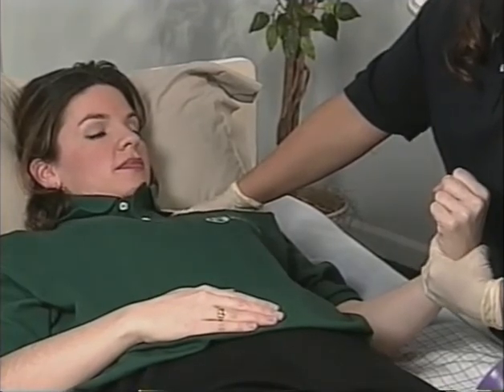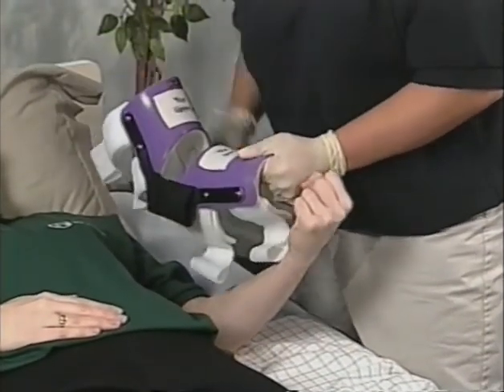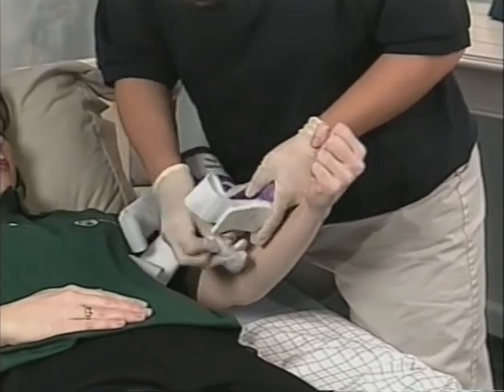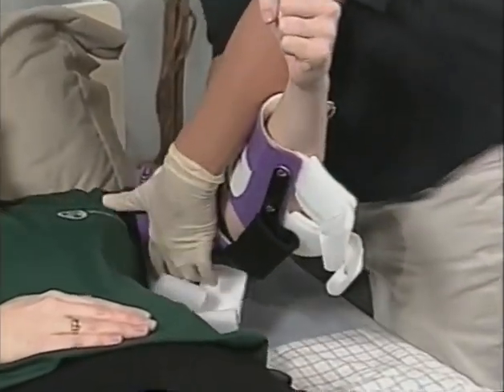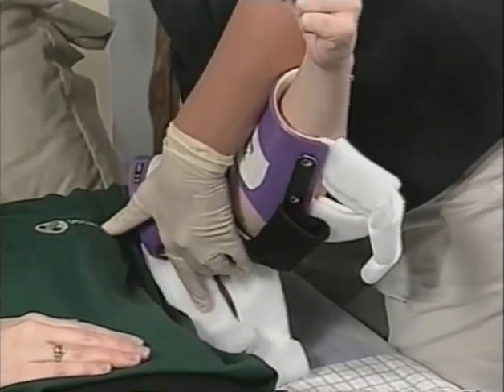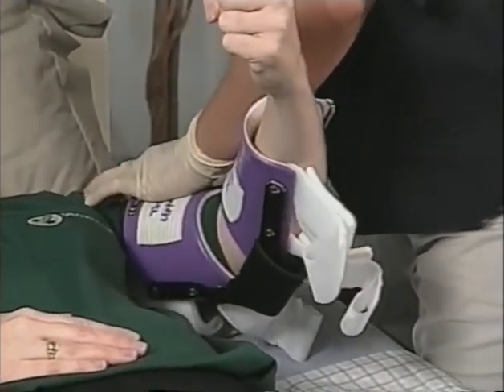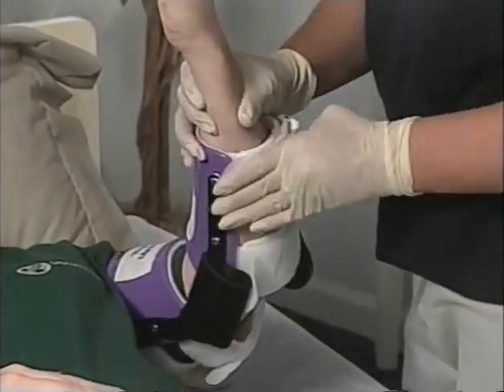When applying the Ultraflex, make sure that the orthotic joint matches up with the client's joint. Place the limb into the orthotic and fasten the straps. Make necessary adjustments and retighten straps as needed.